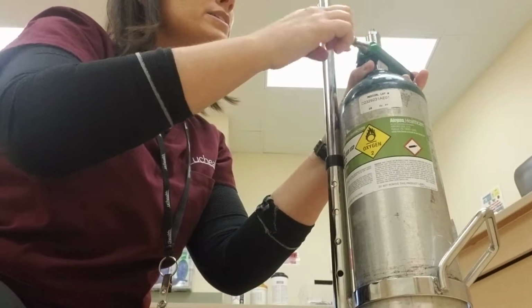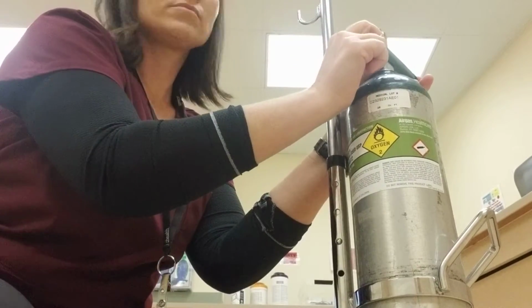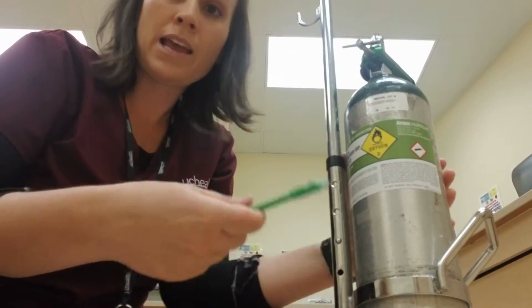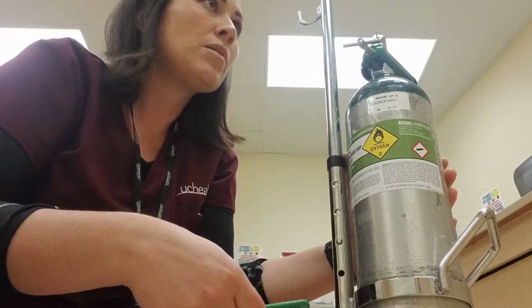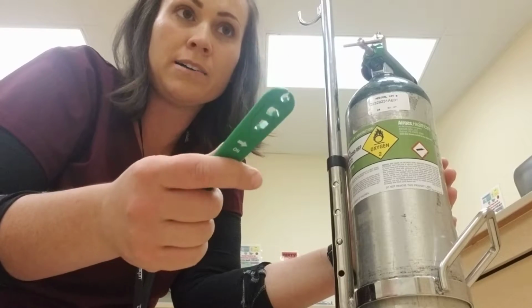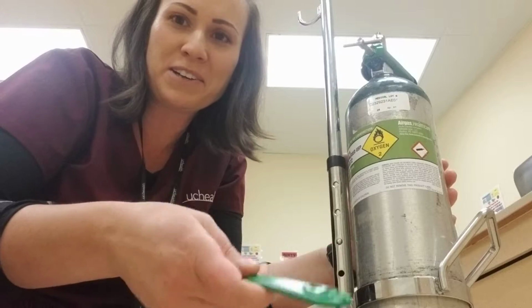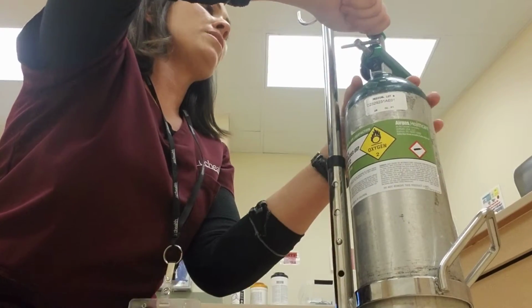And I'm going to go ahead and tighten it. All right, and I have a little wrench here. Go ahead and turn on the gas flow. When I'm cracking the tank, I want to let anybody know that I'm going to crack the tank. You're going to hear loud noise, especially with our H-tanks. They make a really loud noise. So just let anybody know standing by that I'm going to crack the tank.